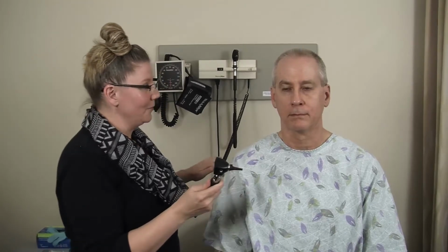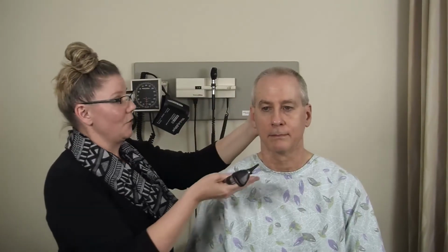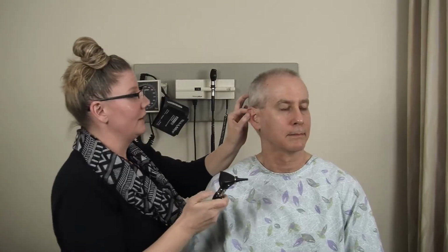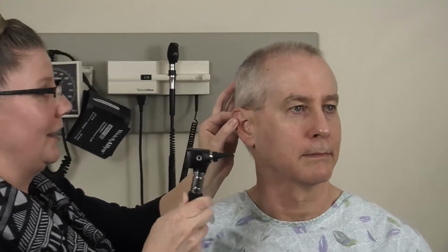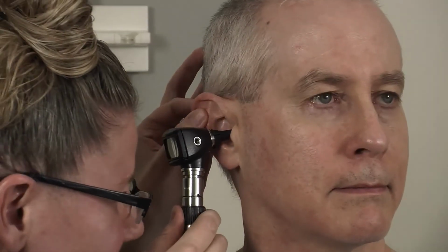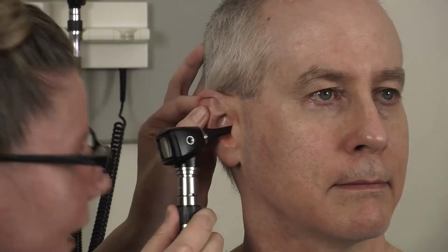So for the exam, what I'm going to do is, the ear canal is actually angled anterior. So I'm going to just tilt you a little bit here. I'm going to pull Steve's external ear up and out a little bit, and I'm going to angle in to take a look. You want to be careful not to be scraping the ear canal because it's a very sensitive area.